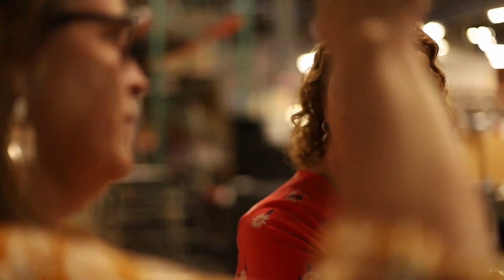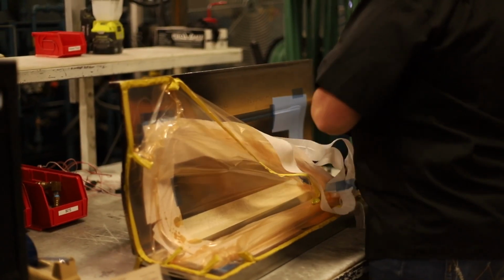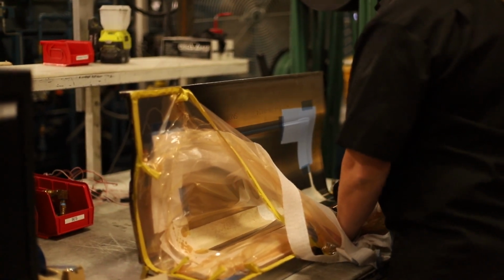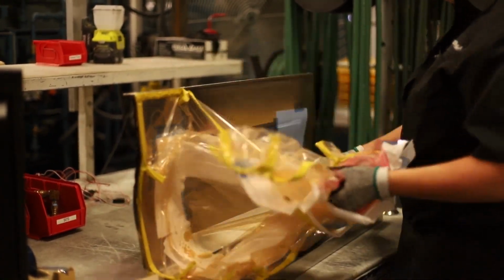And then it heats up, and we have a cure profile where it heats a certain amount and then holds and then pressurizes, and then it heats the full amount, holds till it's cured, and then it'll drop heat and pressure until it's done, and then we can take them out and demold them. And then it's formed, basically. Yep. At that point, the material is fully cured and hard.